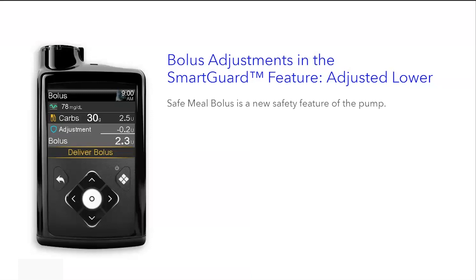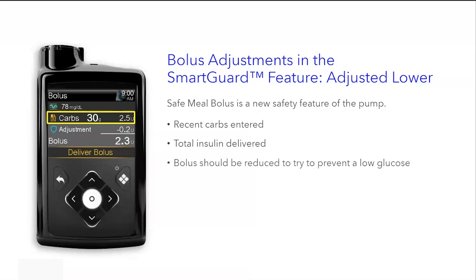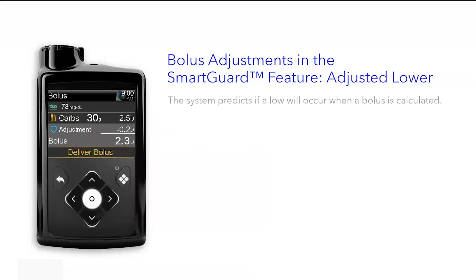Bolus adjustments in the SmartGuard feature — adjusted lower. Safe meal bolus is a new safety feature of the pump. It takes into account the recent carbs entered and the total insulin delivered. It determines if the bolus should be reduced to try to prevent a low glucose. If the bolus is adjusted down to 0.0, no bolus is delivered.